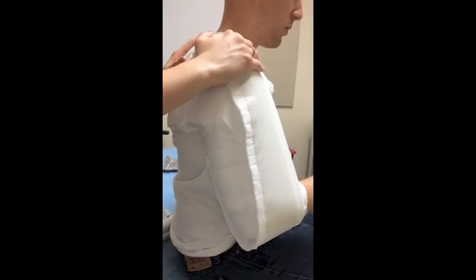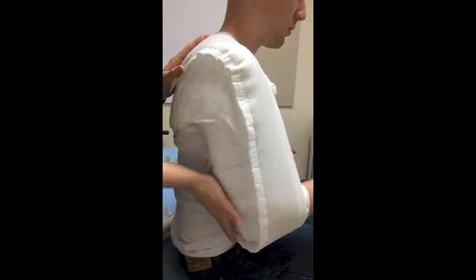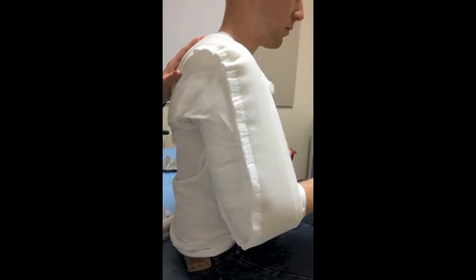So we'll go ahead and just hold this, smoothing out the corners, making sure that our elbow, the material is flush with the elbow here. We don't want too much overlapping for when we go to secure it.